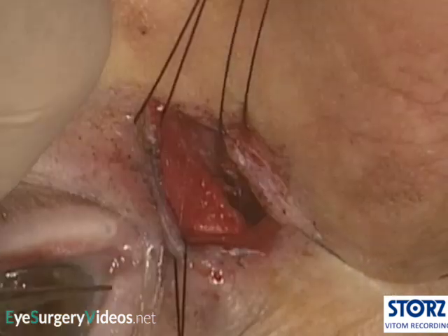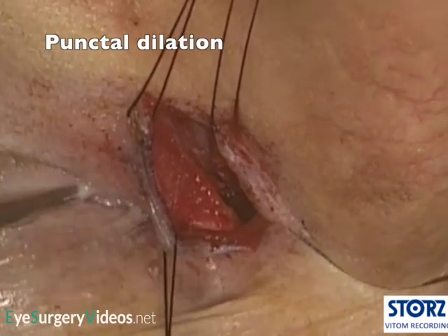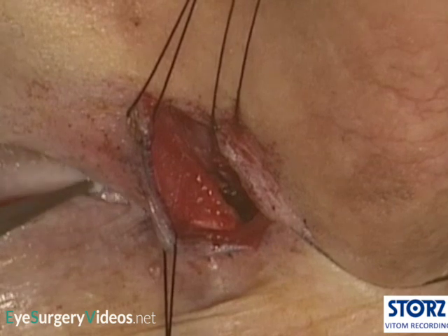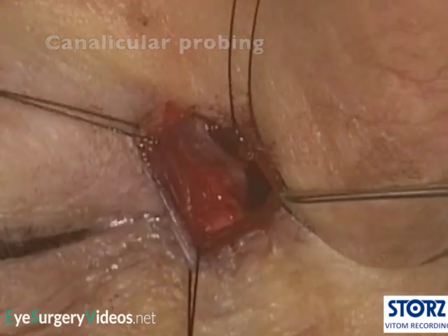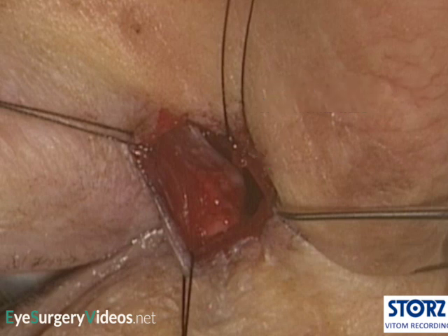The puncti are gently dilated to accommodate a Bowman probe. Aggressive dilatation should be avoided, as this probably disrupts the punctal sphincter, which could conceivably have an impact on tear drainage. A Bowman probe is passed along either the inferior or superior canaliculus and into the intact lacrimal sac. It is used to tent up the sac. The glint of metal should be seen through the translucent sac. If it is not seen, the probe is probably not fully in the sac.